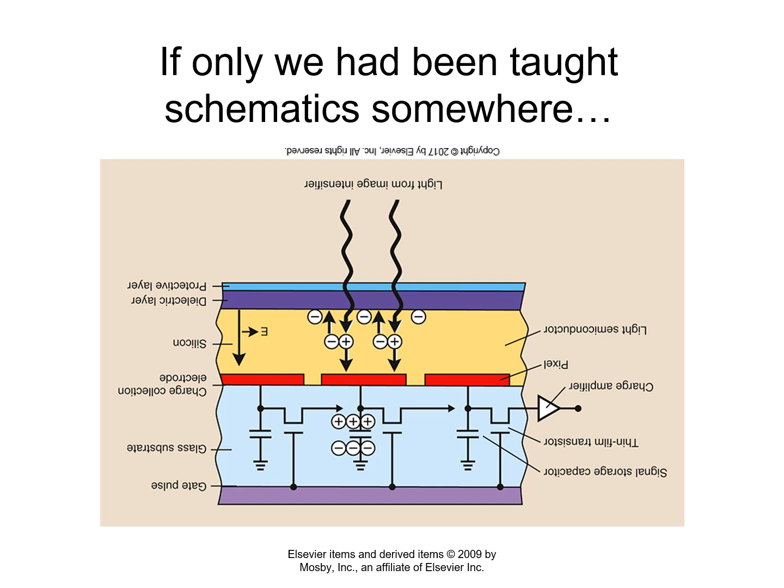So I've turned it upside down because that's how I'm used to looking at the schematic of a CCD. So bear with me that these words are upside down. So the light comes in. There's an anti-scratch coating on the front of your silicon wafer, okay? And then there's an anti-static dielectric layer, okay?